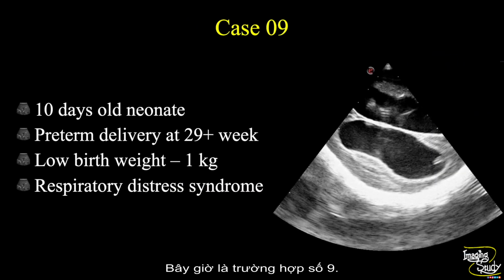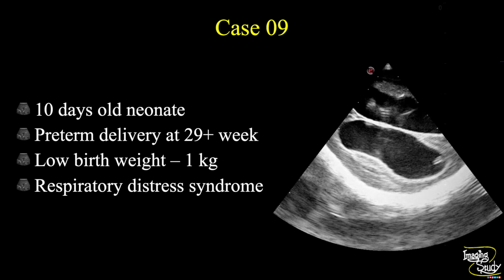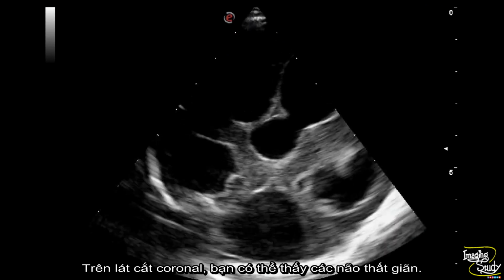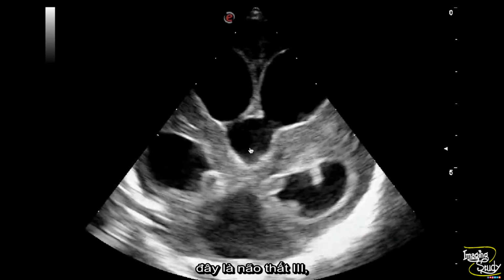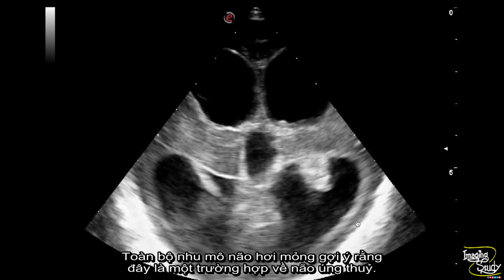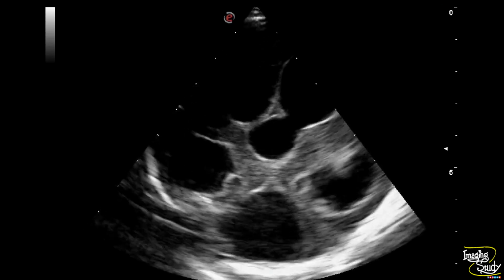Now the case number 9. This is a 10 days old neonate with preterm delivery at 29 plus weeks, with a low birth weight of 1 kg and respiratory distress syndrome. During our ultrasound scan, this is the coronal section. You can see the ventricles are dilated. These are the lateral ventricles. This is the third ventricle. This is the fourth ventricle. All are dilated. The overall brain parenchyma is slightly thinned, indicating it as a case of hydrocephalus.